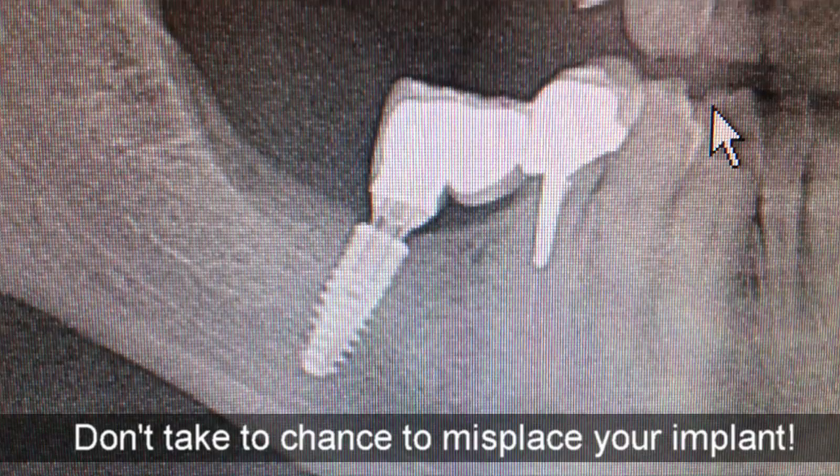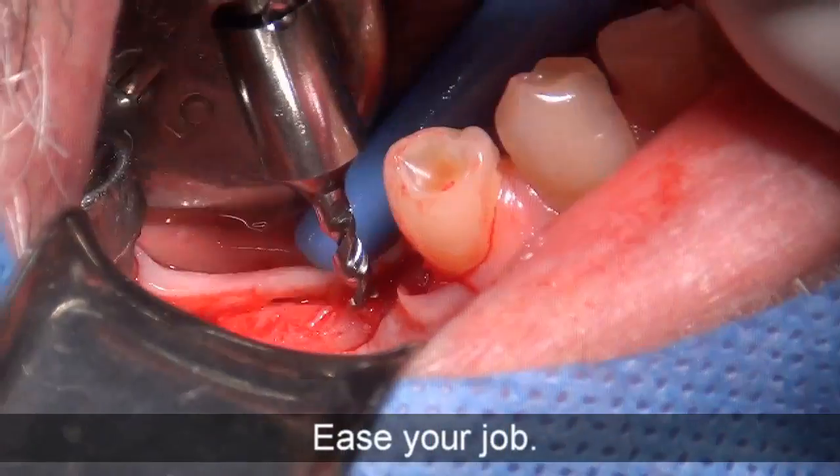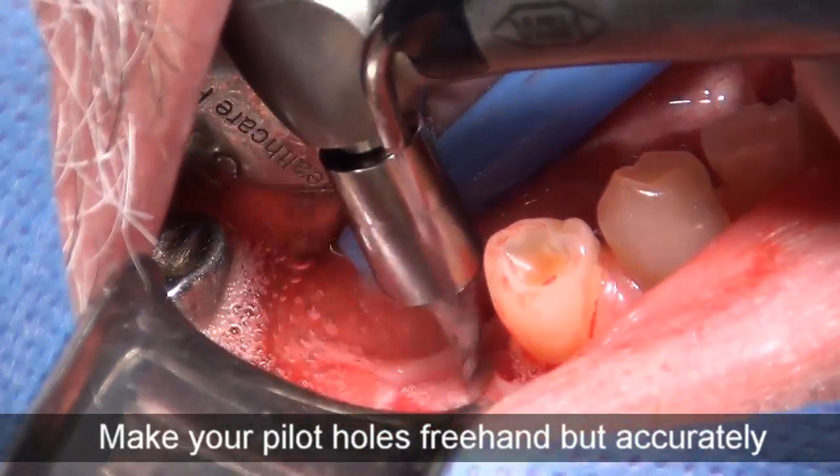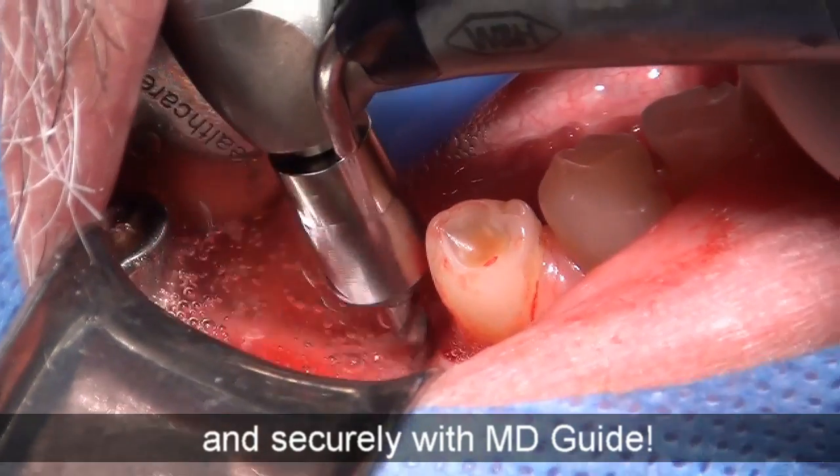Don't take a chance to misplace your implants. Ease your job. Make your pilot holes freehand, but accurately and securely with MD Guide.